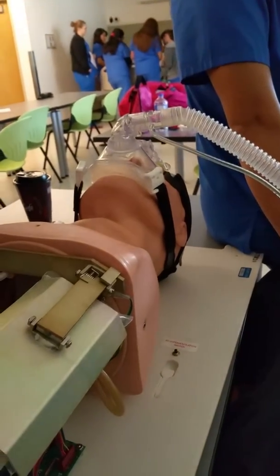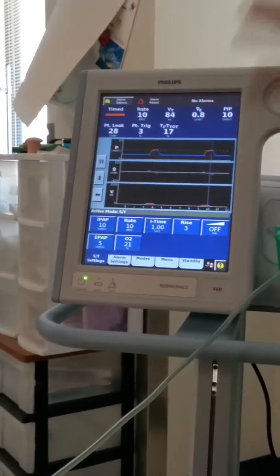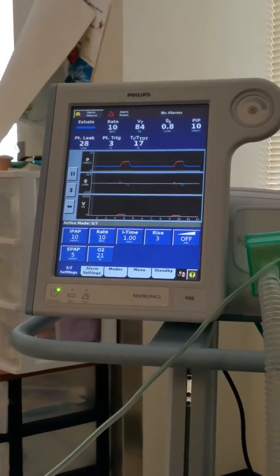Now he's plastic and he's not going to cooperate too much. Obviously that's not a properly anatomic tidal volume for an adult, but I ain't going to go crazy worrying about it, okay?